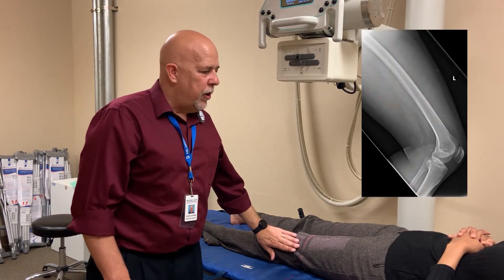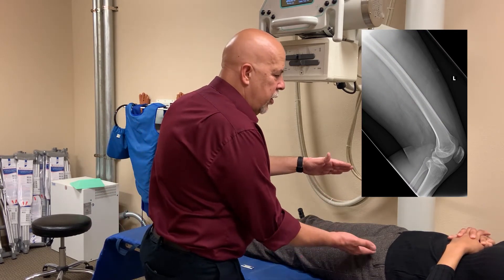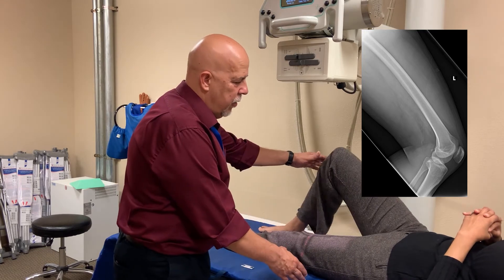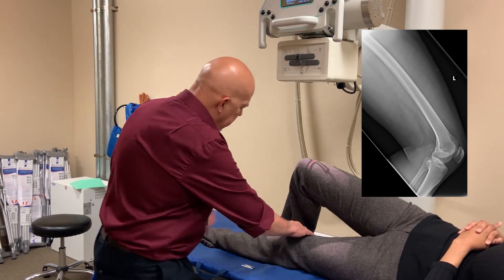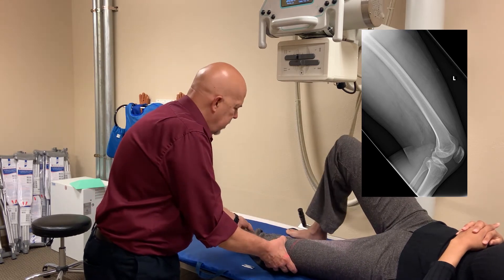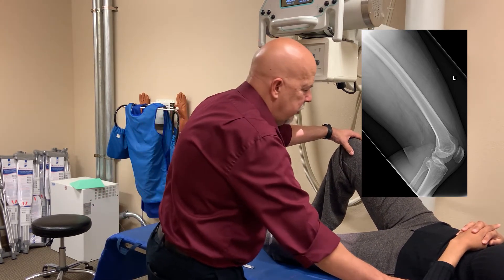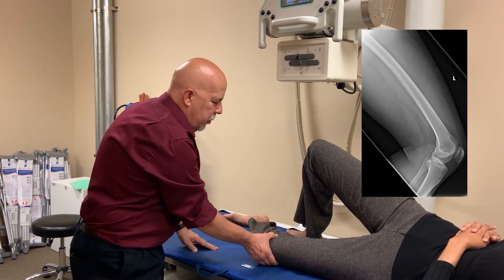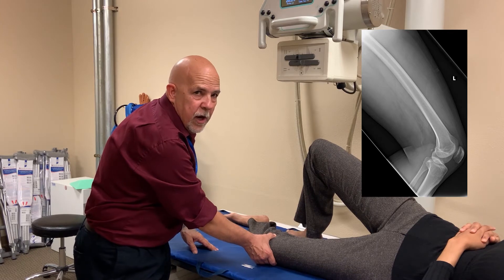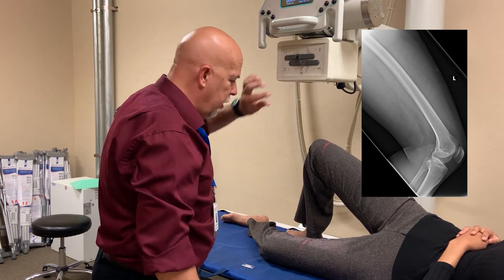Now for the lateral, you want to make sure that the lateral is in a true lateral position. We're going to have you turn most of the way up on your side, not all the way — a little bit more. Then you want to bend the knee, and try to keep your femur in line with the bucky as much as you can. Turn your hip up towards the knee. When your epicondyles on your knee are in the true perpendicular to the IR, then you're in a good lateral position.